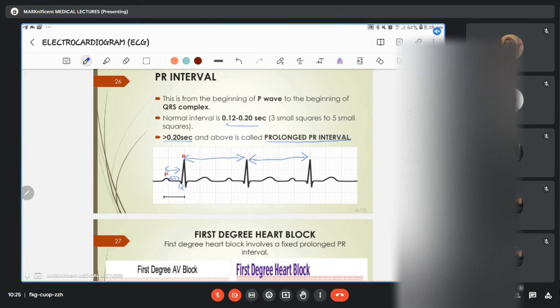So because it is prolonged, because I bet if you count the number of boxes, although this is still showing us 1, 2, 3, 4, but ideally, this is not the typical ECG. This is just printed, but we're seeing 4 here. However, we've been told that it is prolonged. So if it is prolonged, it should be suggestive of bradycardia because you have the smaller boxes. You have more boxes, I mean, and then by the time you divide 300 by the number of boxes, it will give you a smaller number.